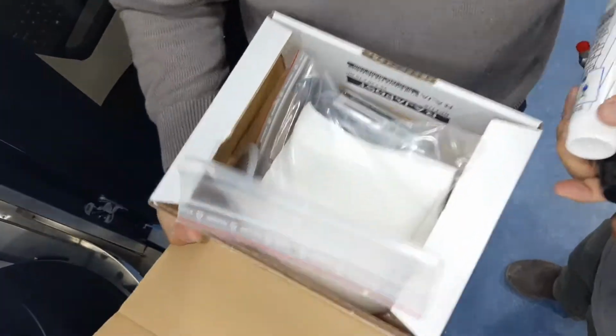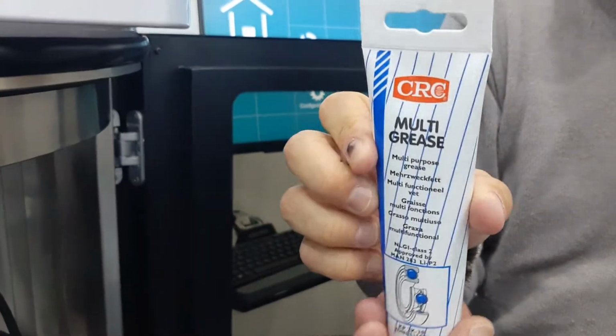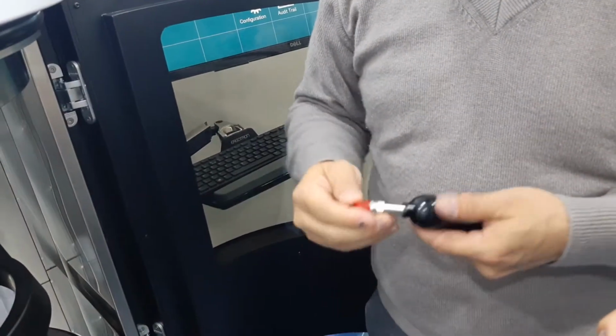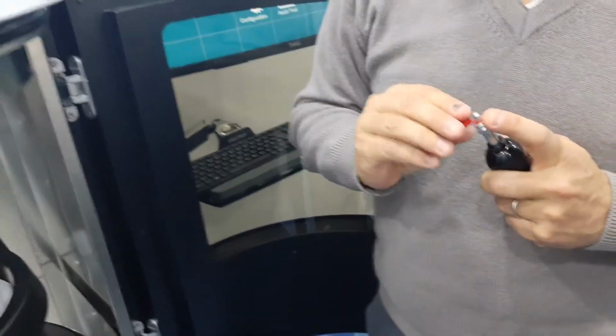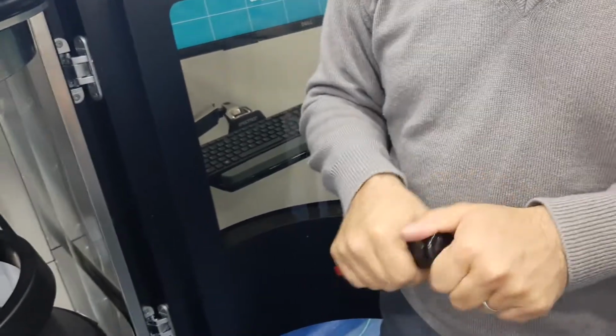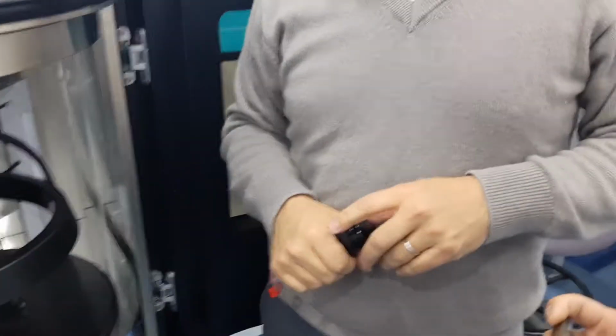I can show you how it's done. There's a special pump. Well, it's not really special grease. There's grease we provide, but it's lithium grease. It's not a grease for ball bearings. And this little pump here. It's a universal grease with lithium, but it must be with the same criteria, the same kind.